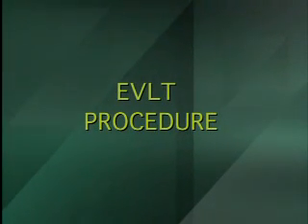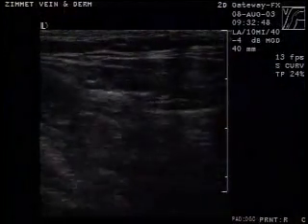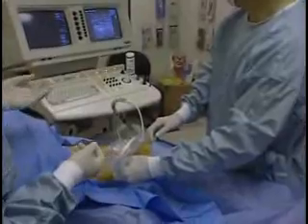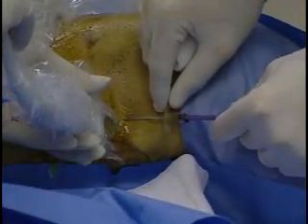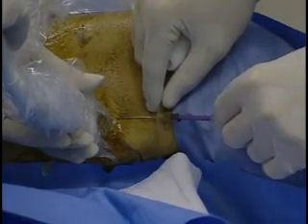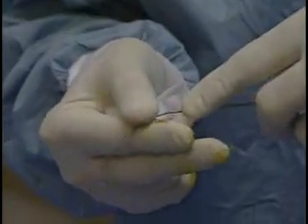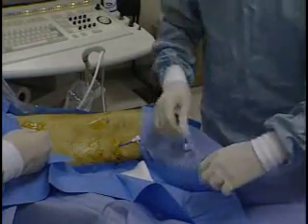The major steps in EVLT include the following. Duplex ultrasound is used to mark the skin overlying the incompetent portion of the GSV starting at the SFJ. The area to be treated is prepped and draped. Percutaneous needle access of the distal aspect of the incompetent segment of the GSV is obtained under ultrasound control. A 0.035 guide wire is placed through the needle up the GSV into the CFV, and the position of the guide wire is verified with ultrasound. A five-French introducer sheath is placed over the wire into the CFV. The wire and internal dilator are then removed once the position of the sheath is verified with ultrasound.